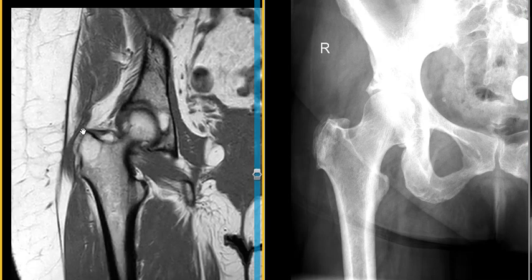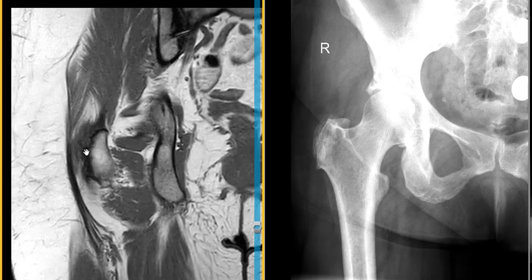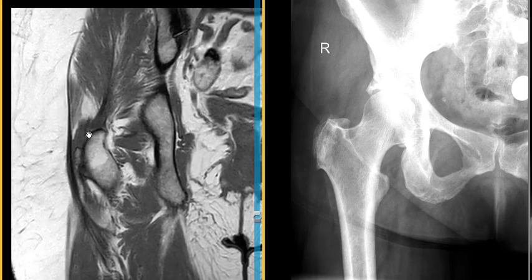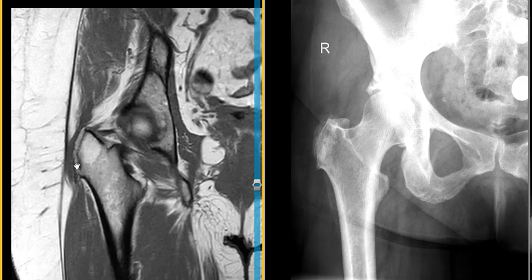On the MRI scan we see that there is this extra layer of bone — the cortex is underneath and then there's a new layer of cortex over the top, so this is periosteal new bone formation. This is right at the gluteus tendon attachments to the greater trochanter. When you have a chronic inflammatory process involving the attachments of these tendons, we call it enthesiopathy or enthesitis. The chronic inflammation can cause new bone formation over the periosteum, giving you this lobulation of the contour visible on x-ray. On MRI the bone is more difficult to appreciate, but we can see this little piece of bone and this strip of new bone over here.